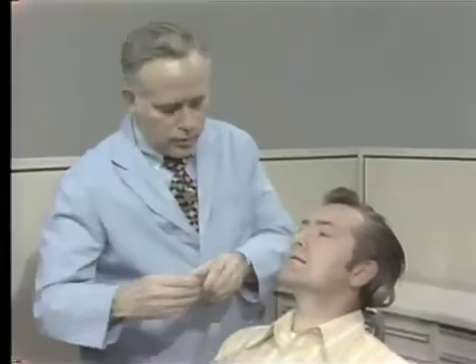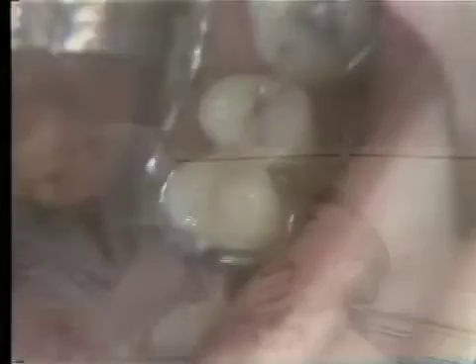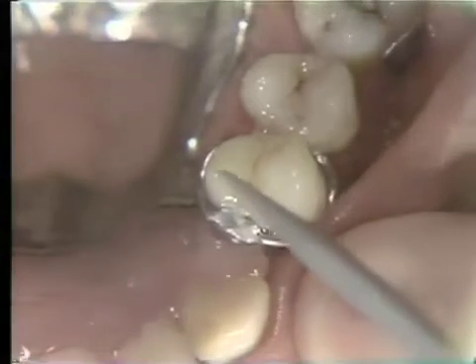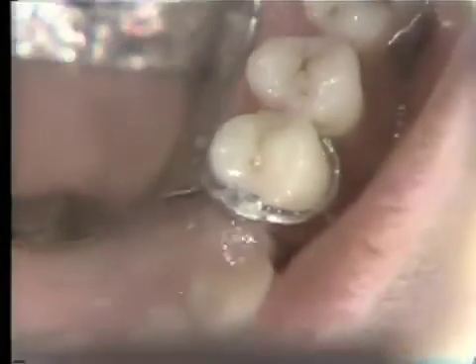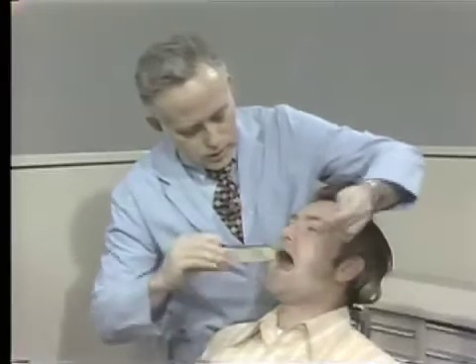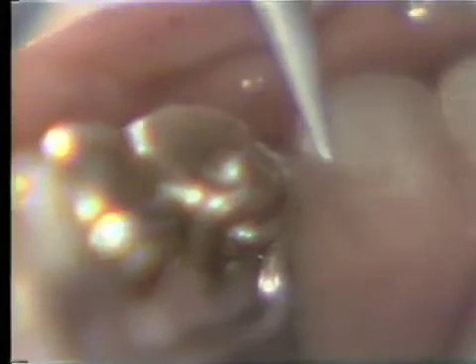If we go back to the mouth, we notice on the upper on the left-hand side that the clasp — that the occlusal rest — has been sheared. We notice also on the lower that this occlusal rest has been sheared.